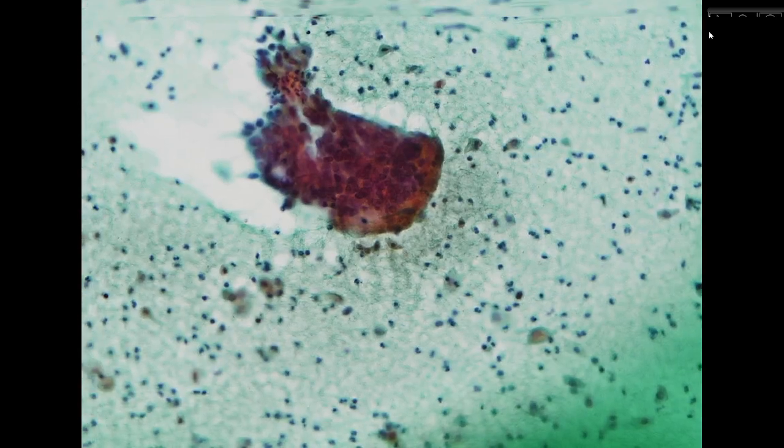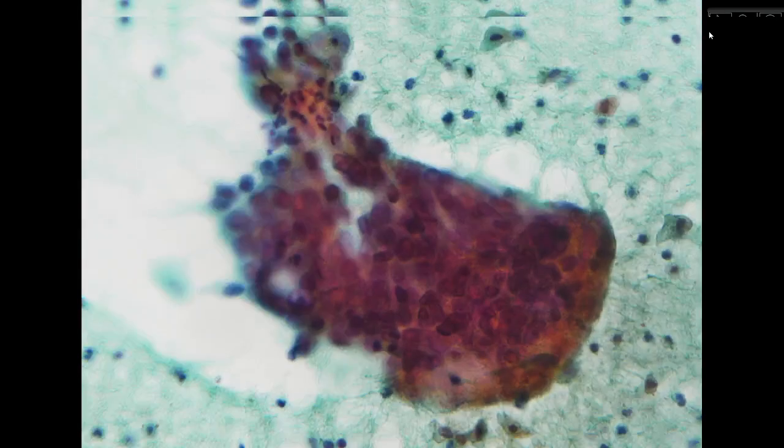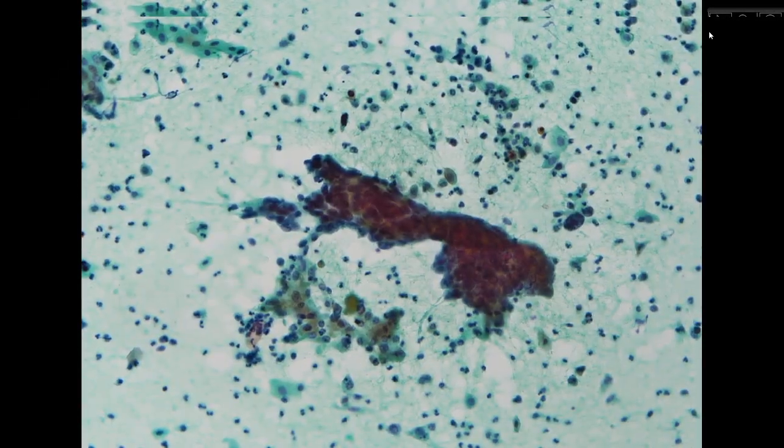What is unusual is that it seems to be quite bloody. So this is one of the first clues that we need to pay attention, that this might be a positive pap smear. Then we do see a lot of very tight clusters showing glandular features, with hyperchromatic and irregular nuclei.